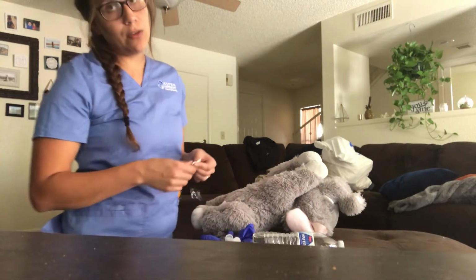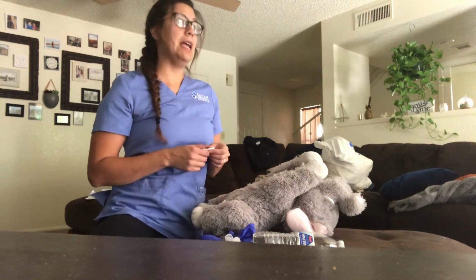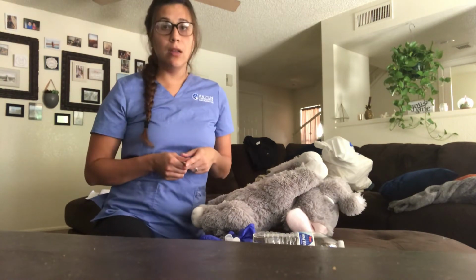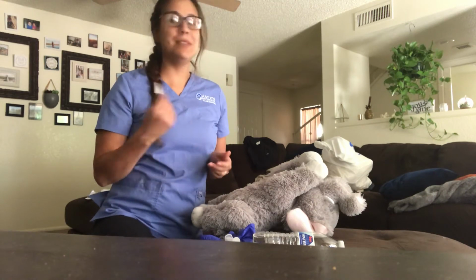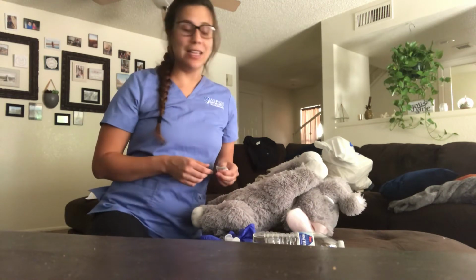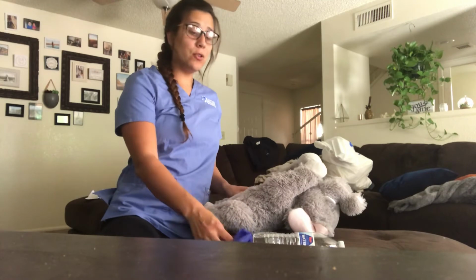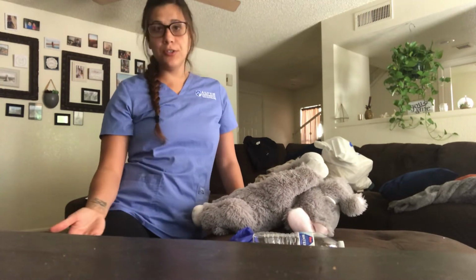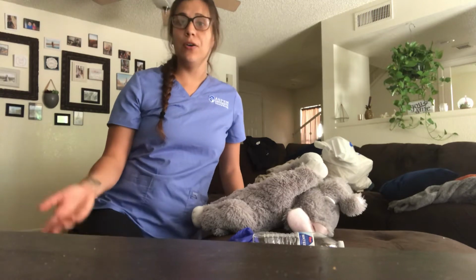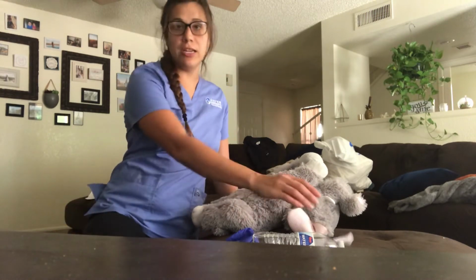With this, you also want to go ahead and grab a pill crusher if you have one. Of course, you would at a hospital, and litmus paper, which I obviously don't have either. But so you gather your supplies, and then you'd go into the patient's room. You would introduce yourself as the nurse and explain that you are going to give medications through that NG tube.